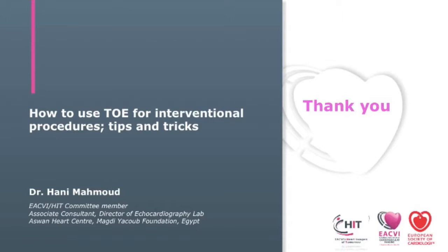We then moved to a very important procedure, the TAVR procedure, which you, Hani, covered very elegantly. We've seen that we can do a lot of procedural guidance, complication assessment and PVL assessment during the procedure. You then switched to the transseptal puncture, which I only shortly mentioned, in a very elegant 3D way to steer this procedure. We then looked briefly at the LAA and at balloon valvuloplasty for stenosis. I think we have all seen very elegantly the use of 3-dimensional and 2-dimensional echo in all these procedures.